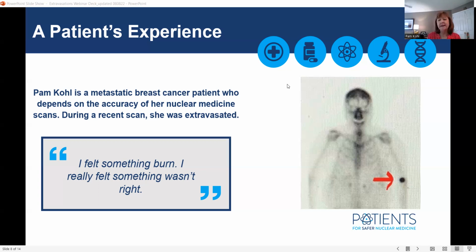And the problem is that we absolutely know that these extravasations are preventable. With retraining and quality control, they are preventable. Technicians need to be retrained if they know that they're extravasating. And I need to know which hospital and which center is doing a good job with extravasation and has protocol about this, and which centers don't. And all patients need to know that.